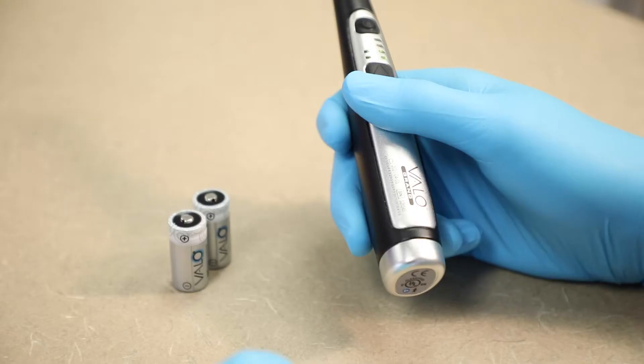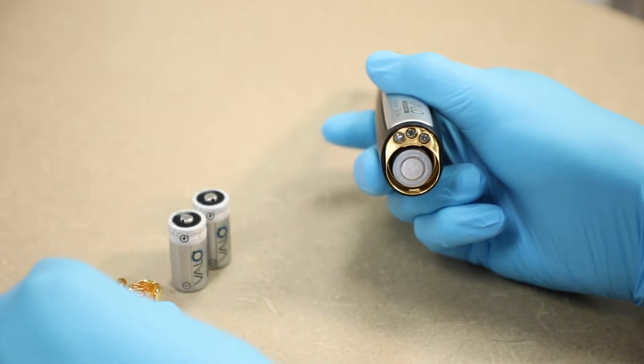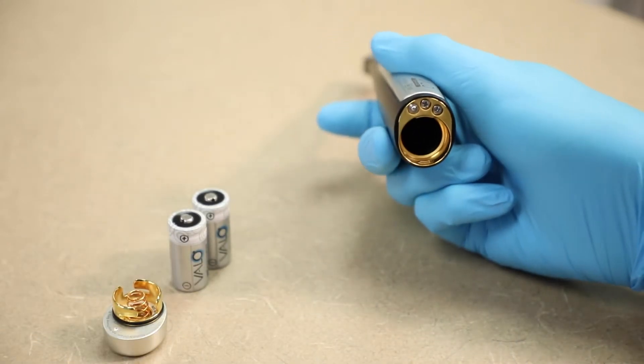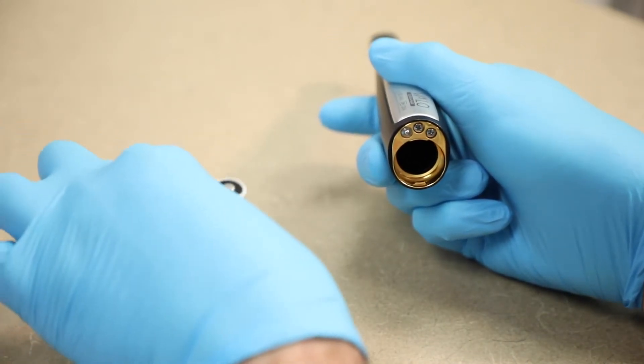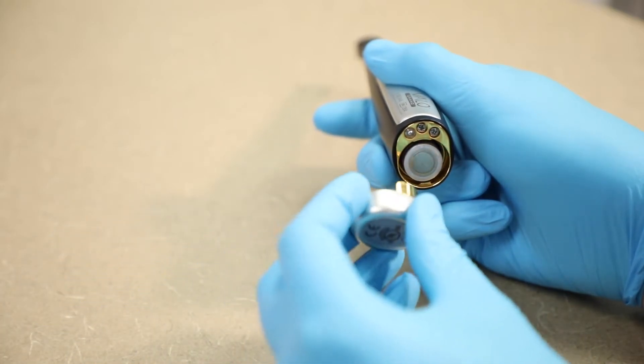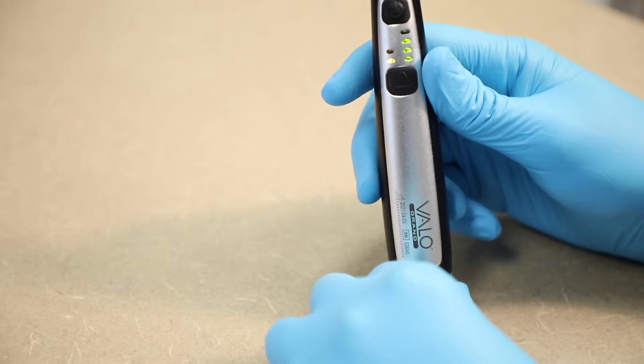To change and insert batteries, remove the back cap by twisting counterclockwise one quarter turn. Remove the batteries. Insert fresh batteries positive side first. Reattach the back cap by aligning and gently pushing while twisting clockwise. Turn the cap clockwise until it stops. The unit is ready for use.